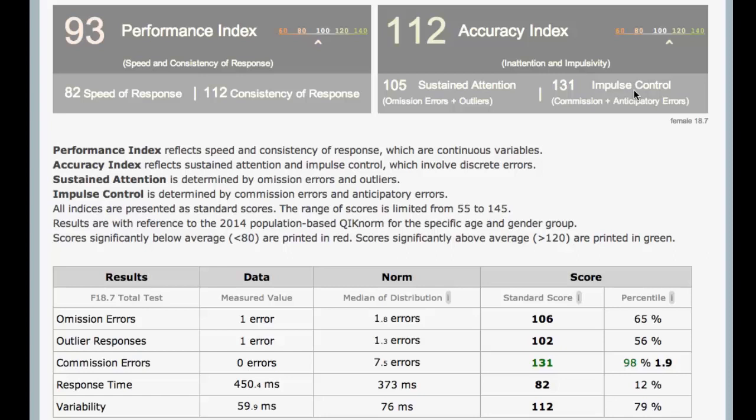So now we have impulse control here. Anticipatory errors — that's responding too fast, faster than your brain could have really figured this out, so within 150 milliseconds. That's really faster than our brain can decide yes, this is a target I'm going to press, or no, this is a non-target I'm not going to press. So that's an anticipatory error when you just see a light and press — that's more reaction time. The anticipatory errors and commission errors — committing an error, pressing when you weren't supposed to press — those get combined into this accuracy index.